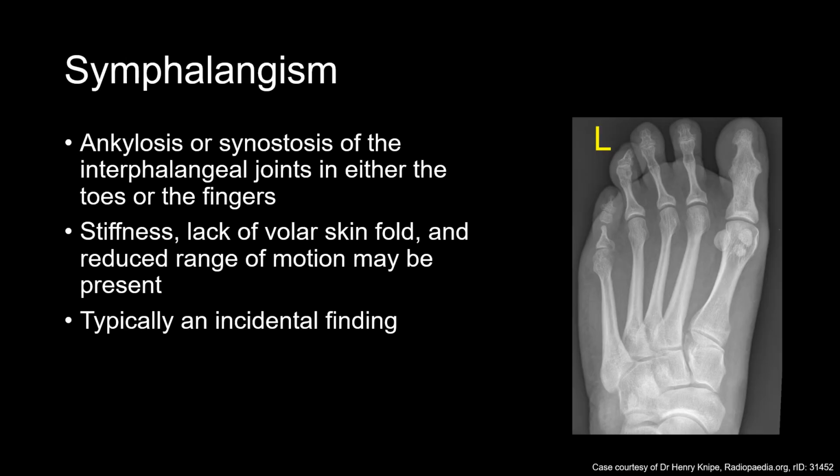Symphalangism is when you have a phalangeal synostosis in a sense. So the digits are lacking their IP joints here, and in this case, the interphalangeal joints are all missing. And so you have PIP, PIP, PIP, and then IP here. The distal phalangeal joints of the second, third, and fourth digits are still present, but their proximals are missing. This can cause just biomechanical aberrations or some uncomfortable type or lack of flexibility, and then usually it's an incidental finding.